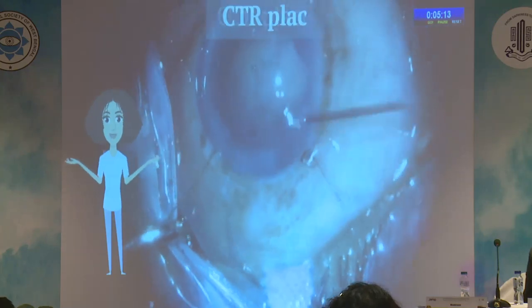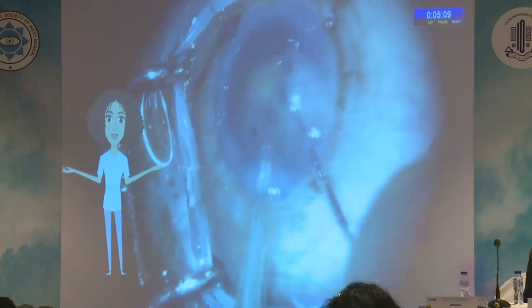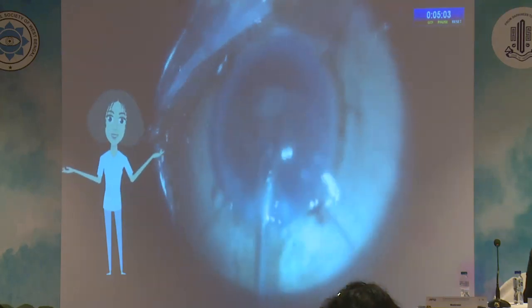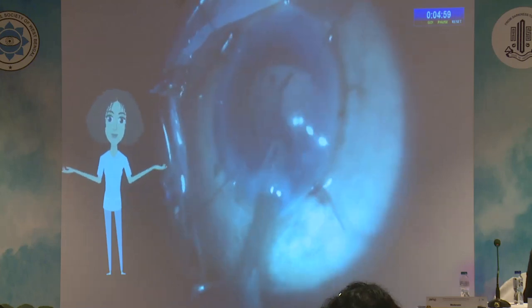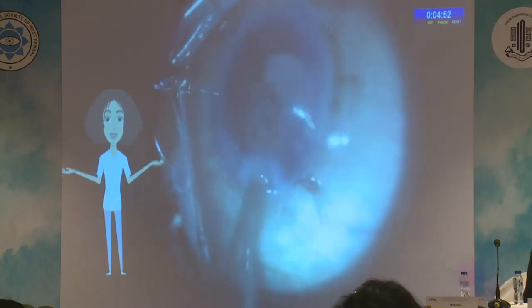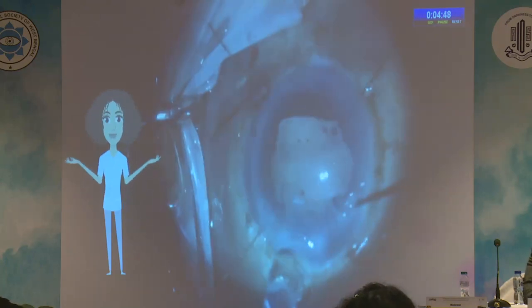He continues the surgery, does the chop and the phacoemulsification easily. Now that the capsule hooks and the CTR are holding the bag firmly, he comfortably does the cortex aspiration carefully and gently. He implants a foldable IOL into the bag.